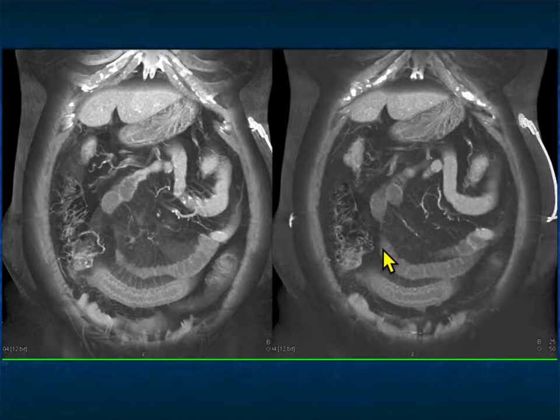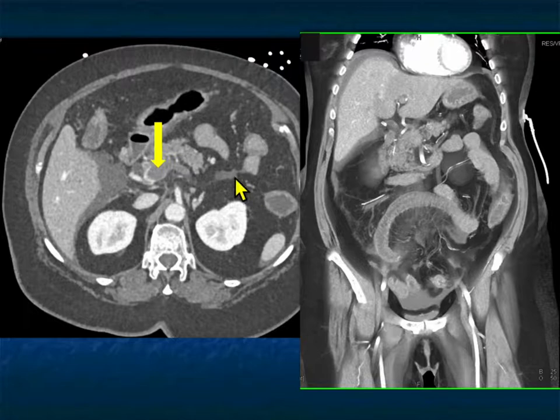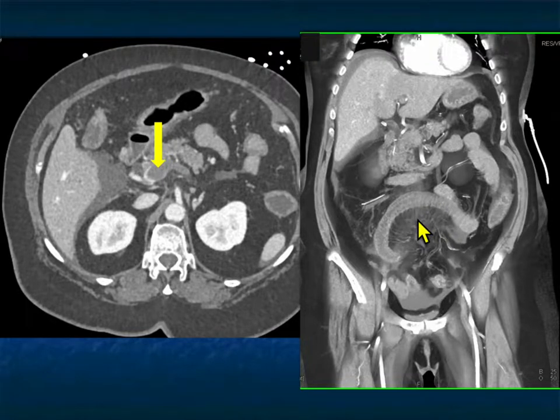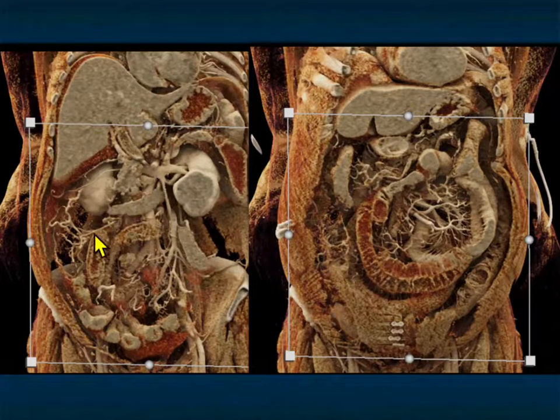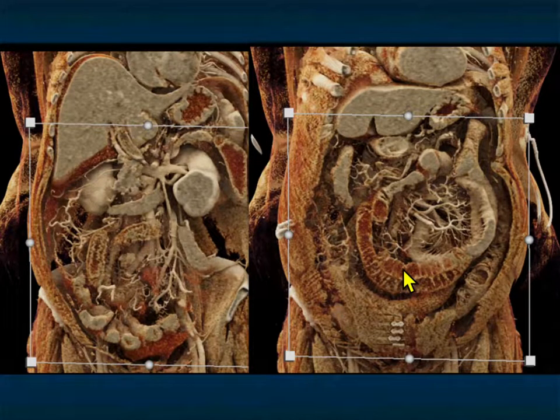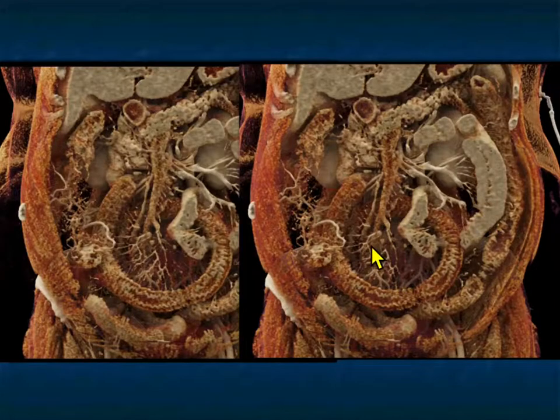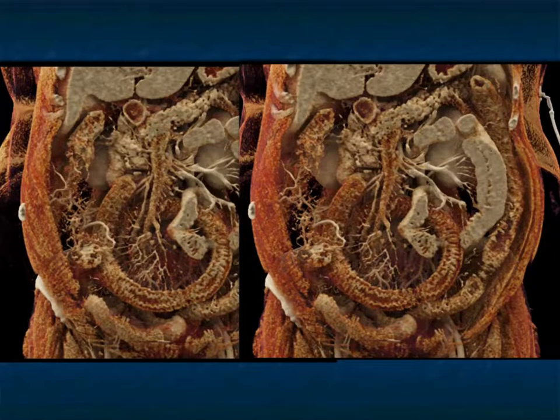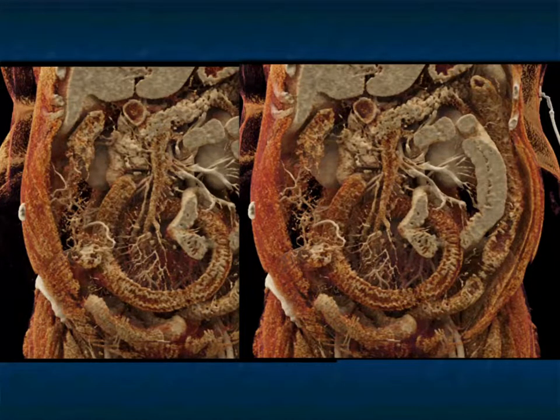With ischemia you often see long segments of bowel — similar to Crohn's but the appearance and layering is different. There's the thrombus at the portal vein-SMV junction, free fluid, and different bowel wall layers classic for ischemia on cinematic rendering. When the vasa recta are small, you have to think about a low flow state. The mucosal enhancement, submucosal edema, and wall thickening are all nicely shown.